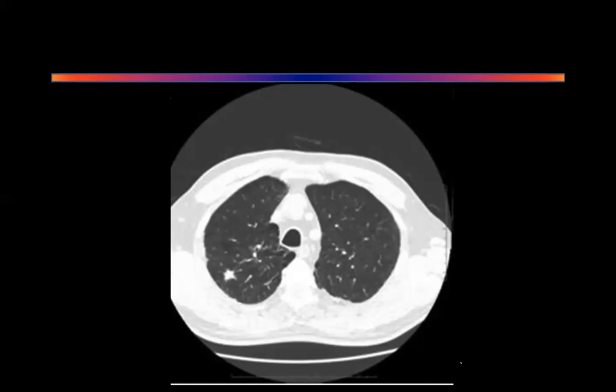Okay, is Simran with us? Yes, sir. Simran, take this, please. So this is a contrast enhanced CT scan showing the lung windows and the mediastinal window. There's a spiculated lesion in the upper lobe, uniformly dense with the surrounding lung parenchyma. Next, what do you want? I'd like to see a previous CT scan of the same patient to compare with this scan for change in size. And what do you want to do? So, 2 millimeters change in size. What do you want to do next?